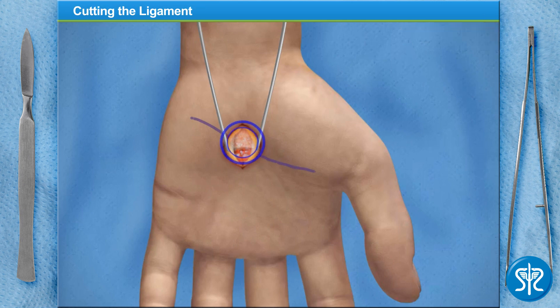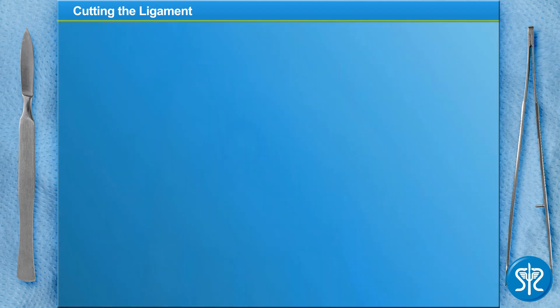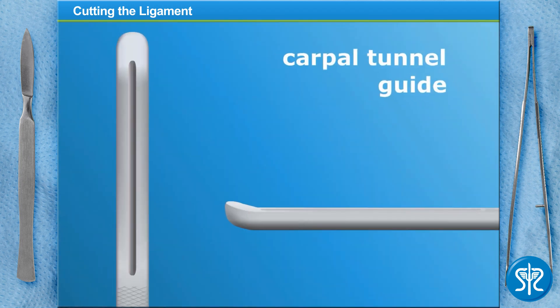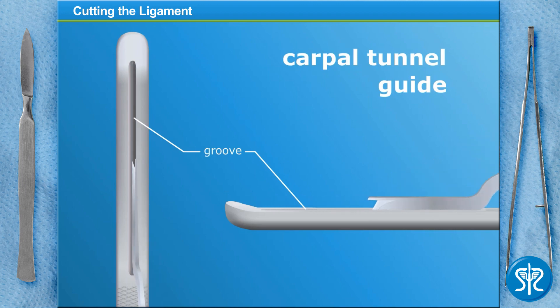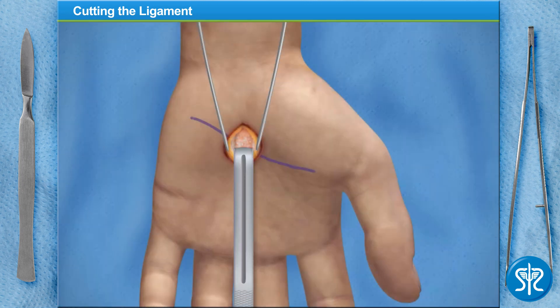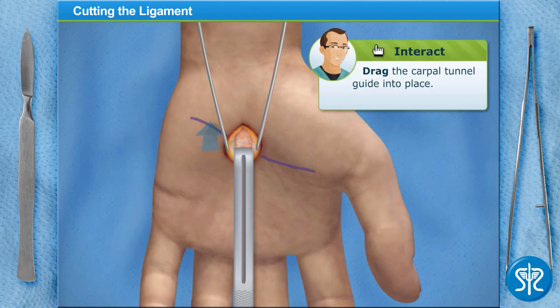With the transverse carpal ligament exposed, I'll need you to slip a carpal tunnel guide into the incision. This is a blunt-tipped instrument with a groove on the upper surface to accommodate a special knife. The carpal tunnel guide is placed down the carpal tunnel and underneath the ligament, and is used to protect the underlying nerve and tendons. Go ahead and push the carpal tunnel guide into place.